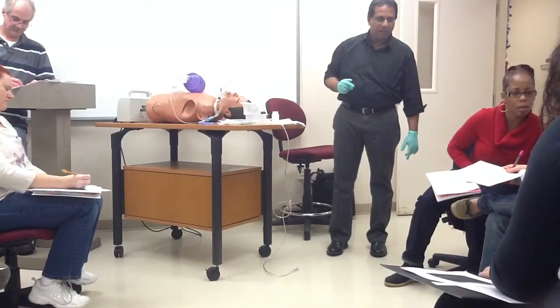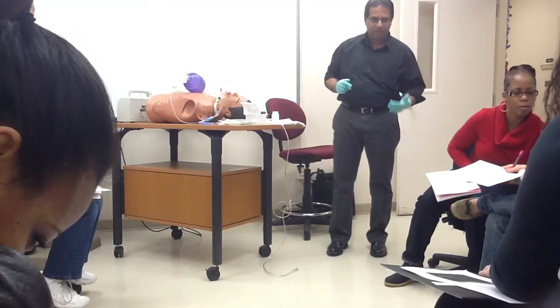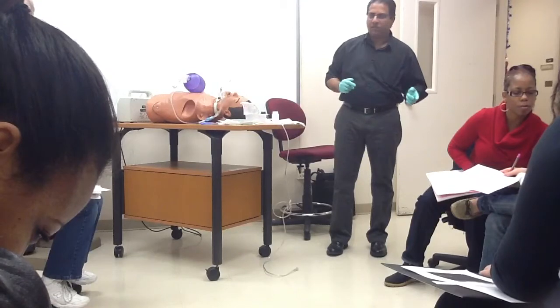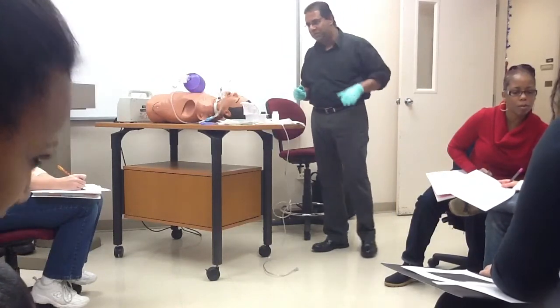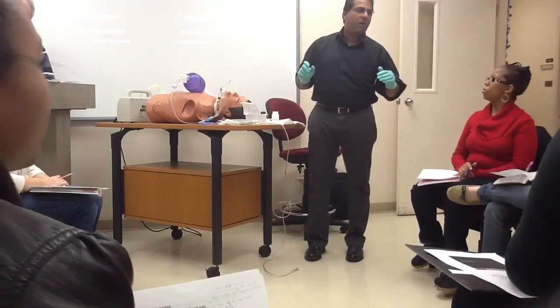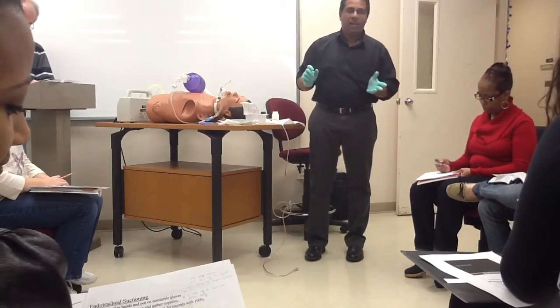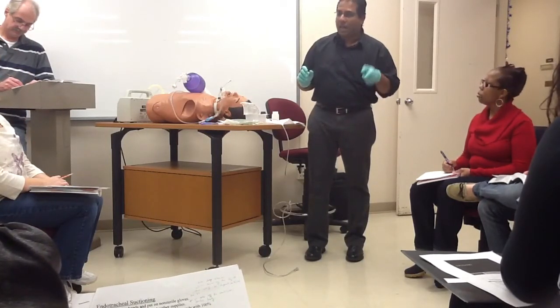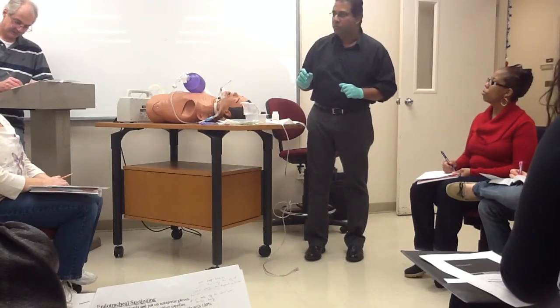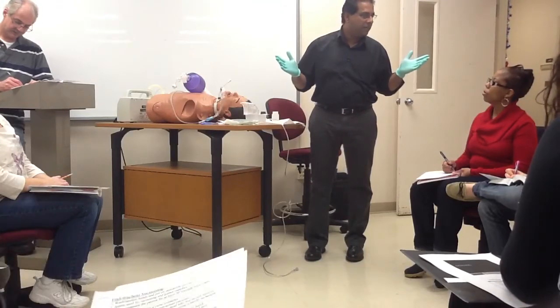Okay, so it's 0.5 times the inner diameter in millimeters, times 3, plus 2. There we go, that equals the French suction catheter size. Now, what we're going to do is take half of the trach size. The trach size is what? 8. Half is 4, times 3, plus 2. 14 French catheter. Okay?